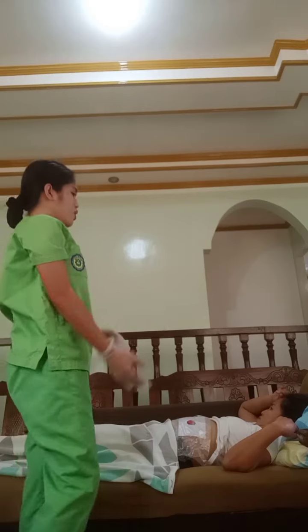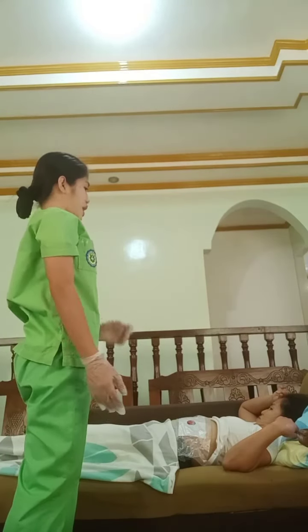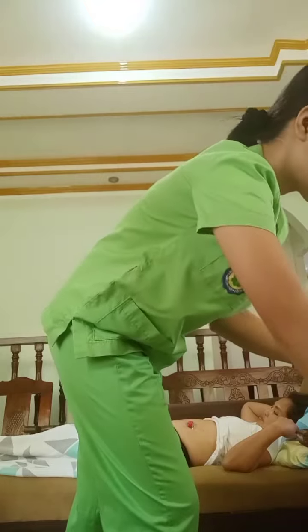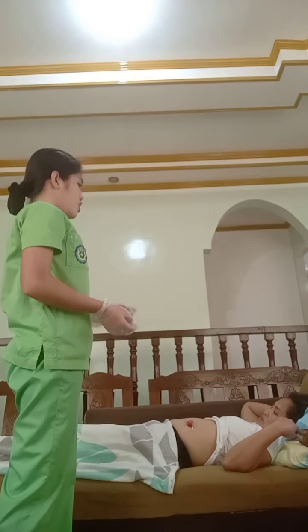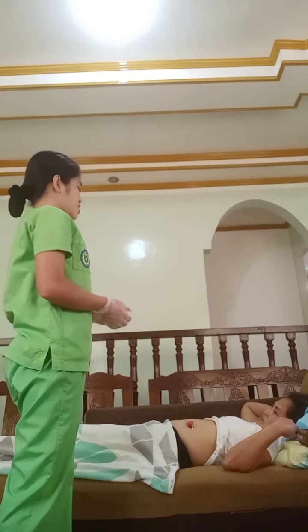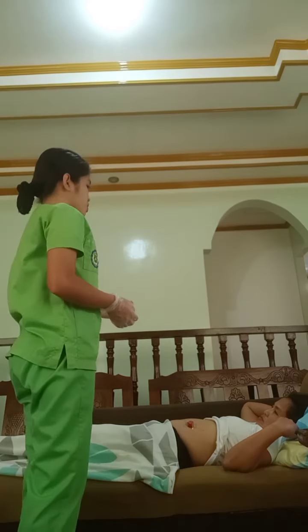And then now we will be able to remove the old colostomy bag and wipe off the residue of the stoma as well as assess the peristomal skin for its color, shape, and appearance, and if there is any abnormal redness.